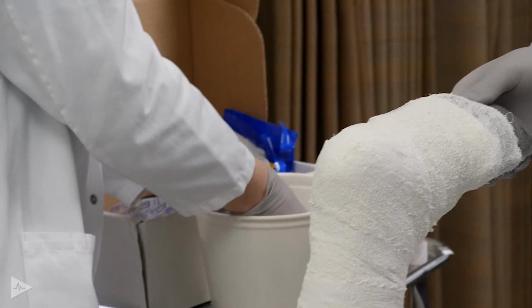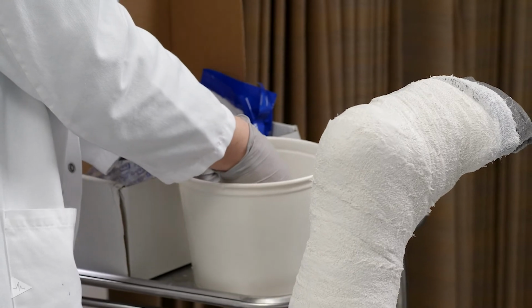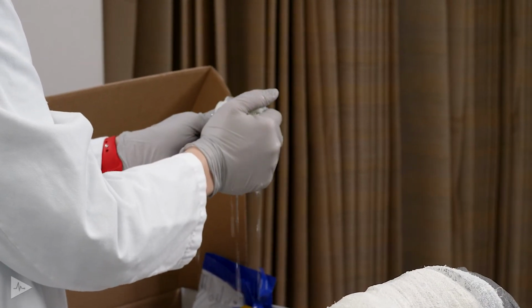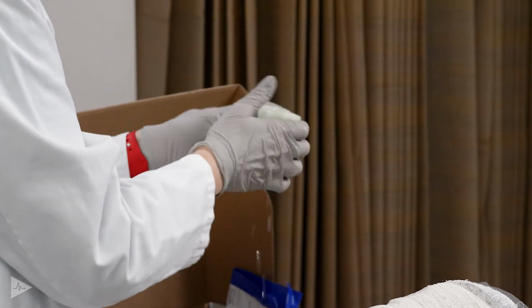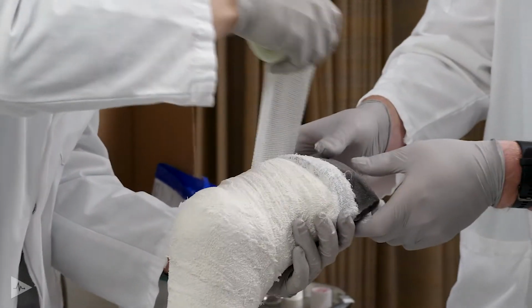It's a little hard to hear, but you'll notice bubbles. So roll the piece back and forth to get all those bubbles out. And again, squeeze out all the excess water, hanging on to that leading edge of the fiberglass. This will roll right over the plaster overlay.